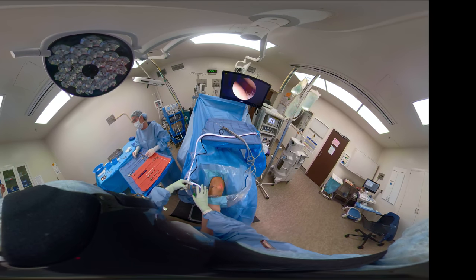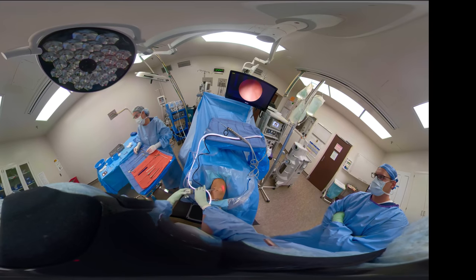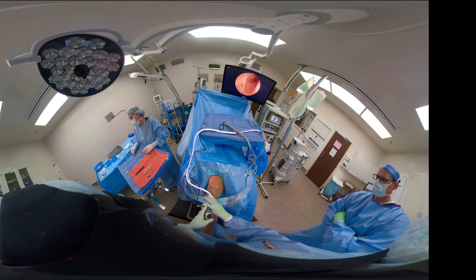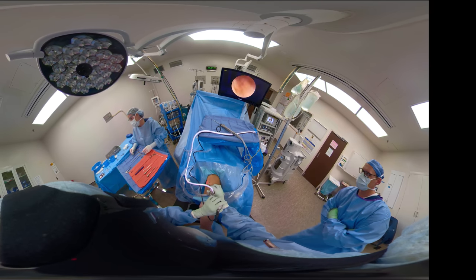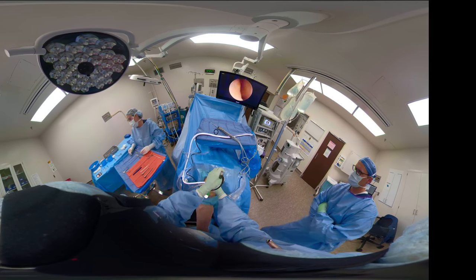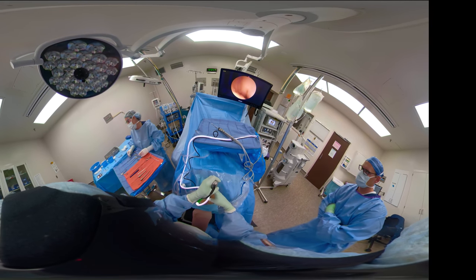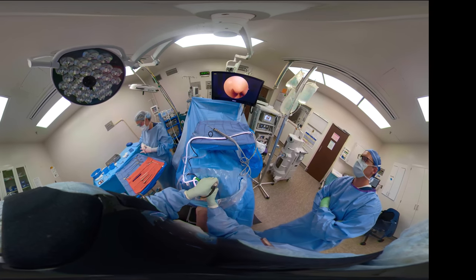So with this, you keep the leg in neutral, go into the medial lateral compartment. That's the medial compartment, lateral gutter. Look for any further loose bodies in the lateral gutter. And then you come down into the popliteus tendon area, where if there are some small loose bodies, they may lie there. So I'm looking for loose bodies.